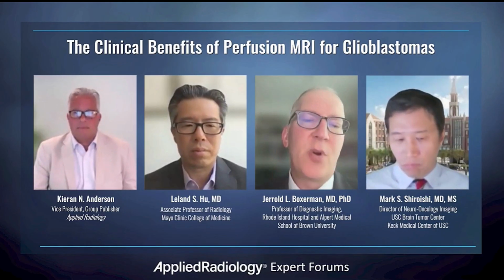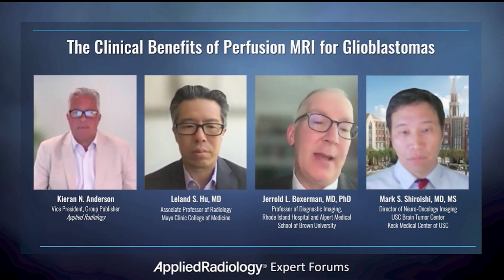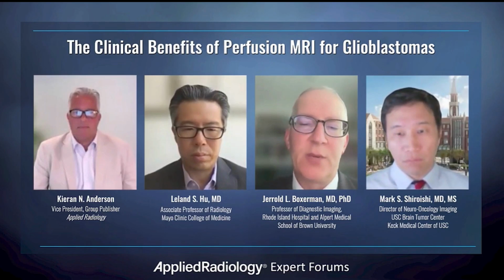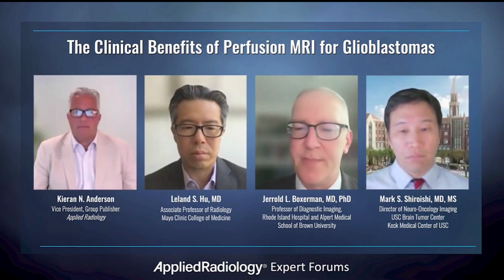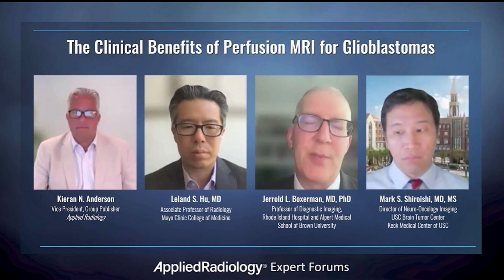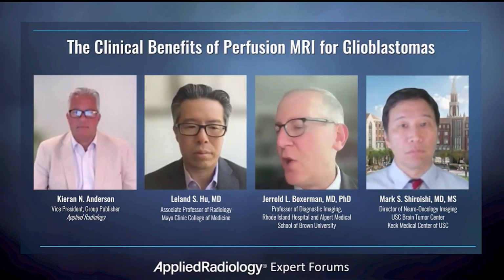So the consensus protocol was set up to ensure that the same amount of contrast is used for both. So really, when you're talking about adding perfusion MRI, DSC MRI to your protocol, it really doesn't require any additional contrast injection unless you want to go with the full dose preload approach, which, as I mentioned, may have some limited advantage if you're considering the simultaneous acquisition of DCE MRI. But for most purposes, our recommendation is to use this low flip angle, no preload approach.